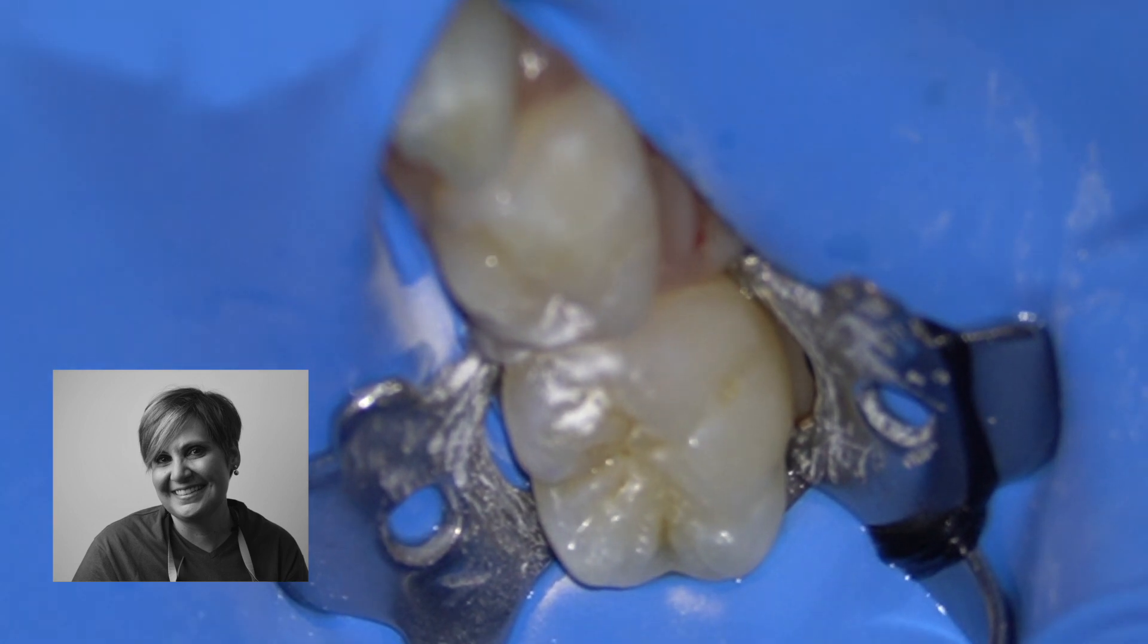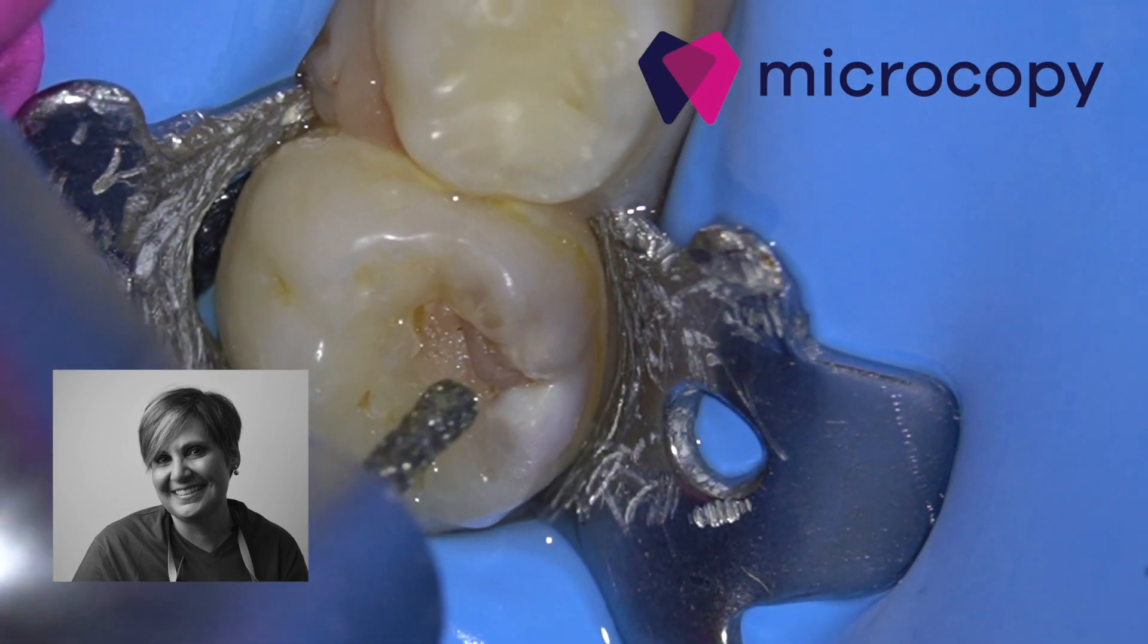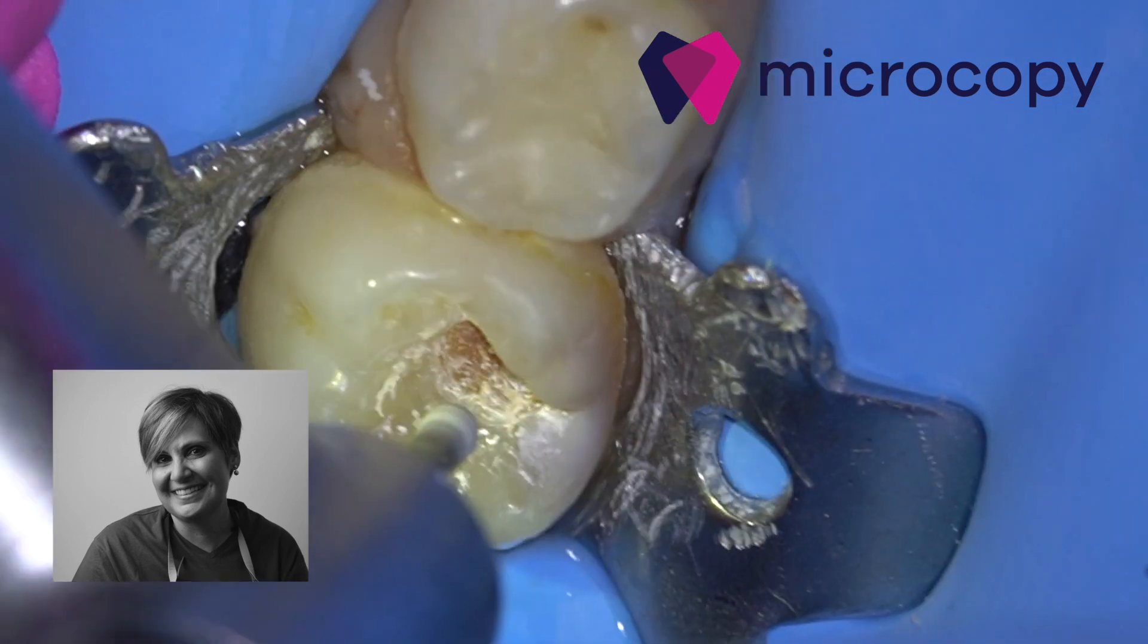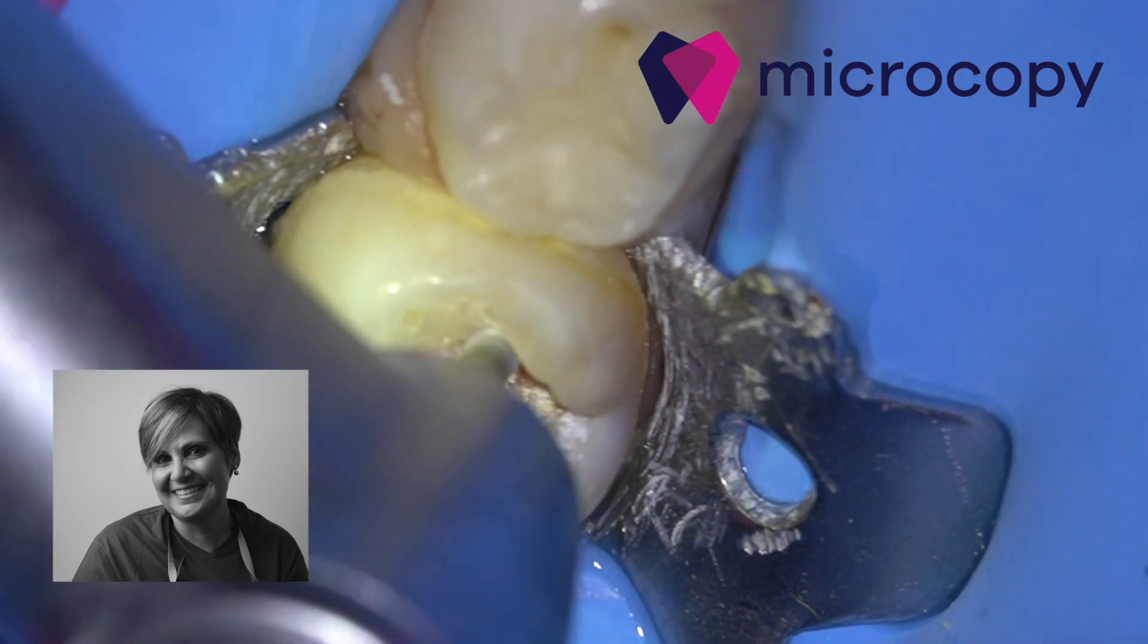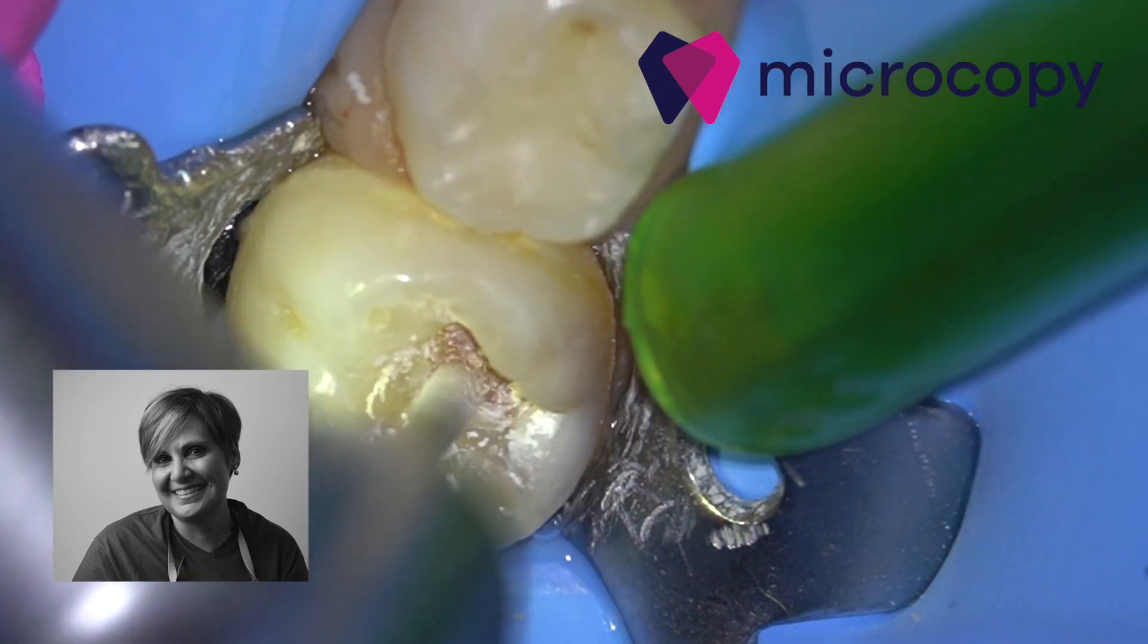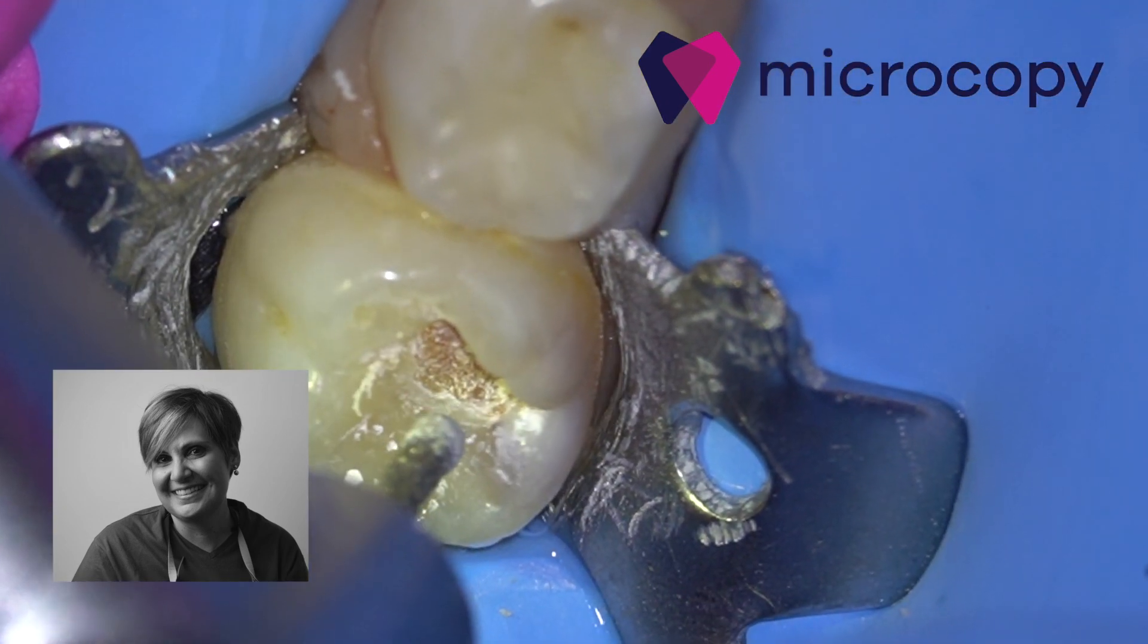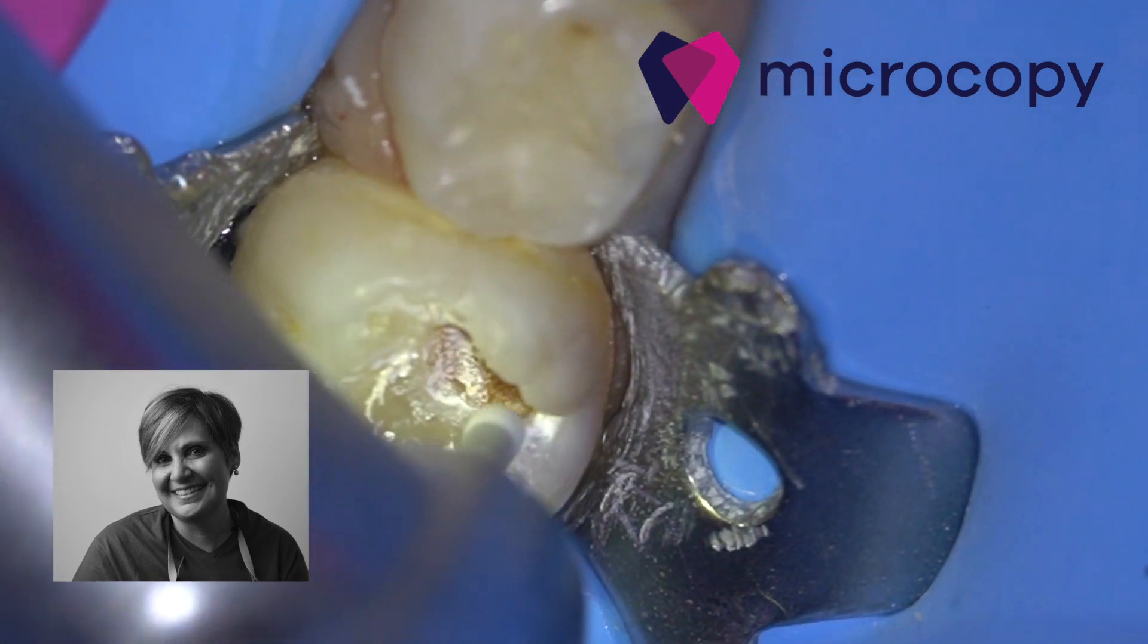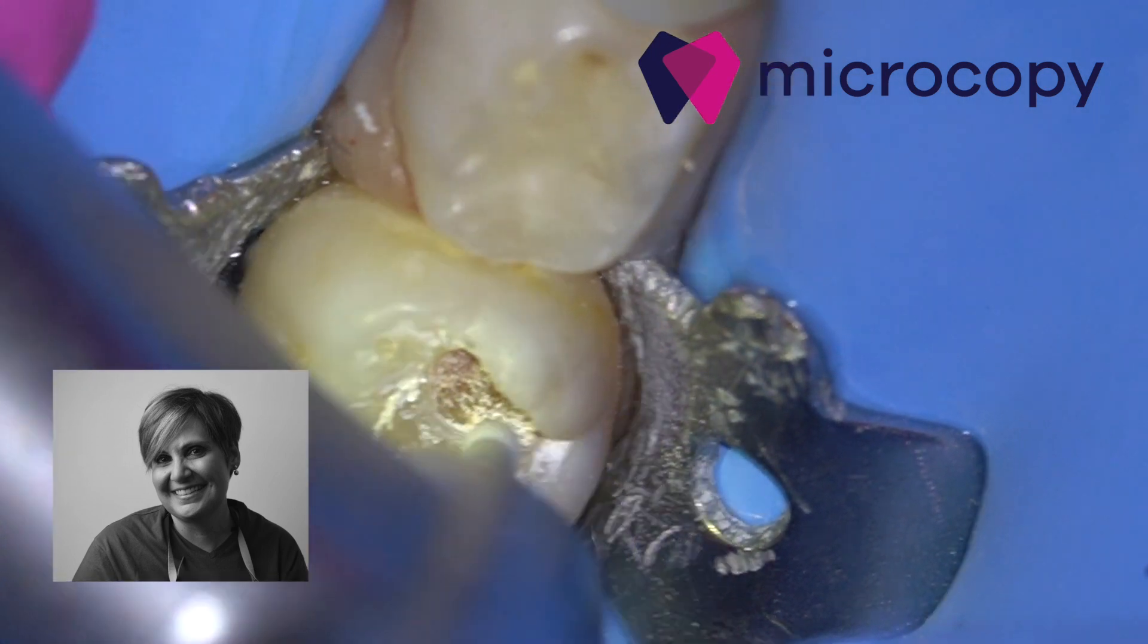On the contrary, with the microcopy bur we are much more effective and we have a deeper cut with less effort. And we are very precise to define the margins of our cavity.